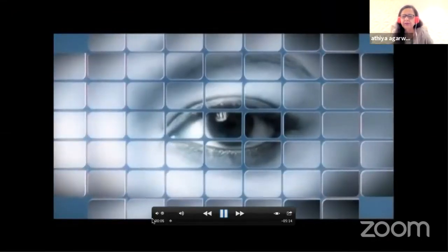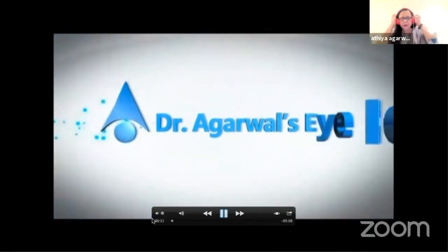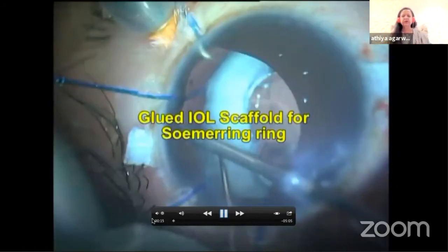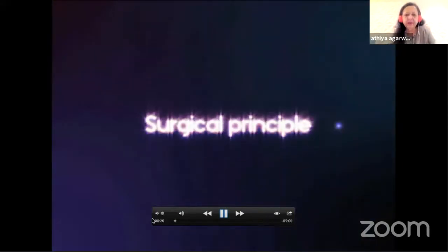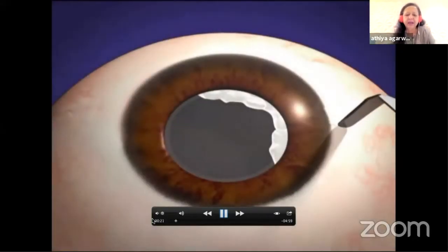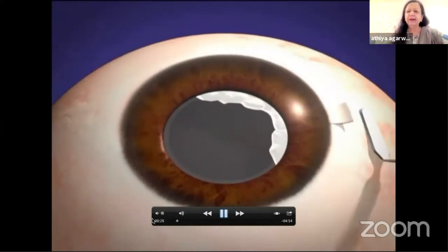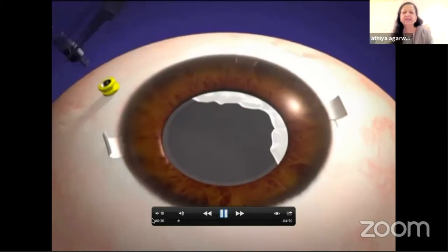I took up this topic to show you all how we can do a glued IOL scaffold in difficult situations like this. What I'm going to show you here is a white ring, which is present behind the iris. These are the animations for the same. I just want to explain to you with animation how we do a glued IOL scaffold in this case.